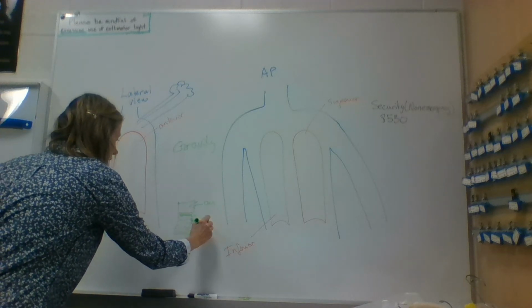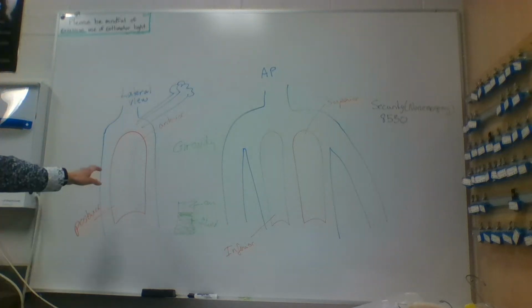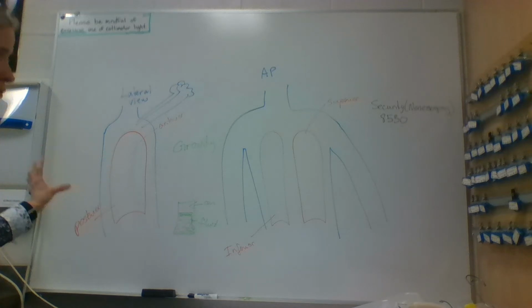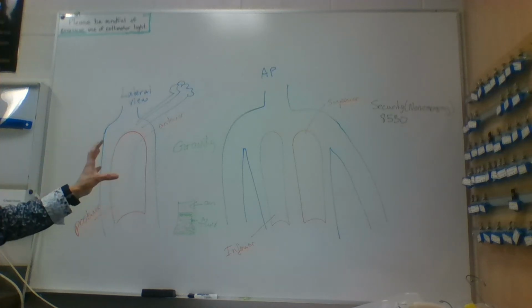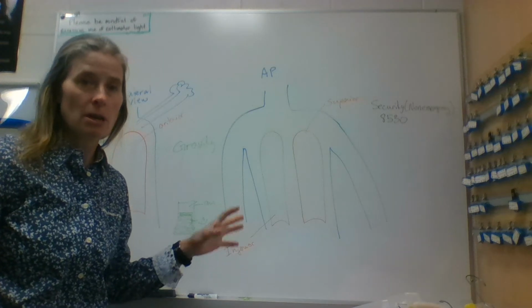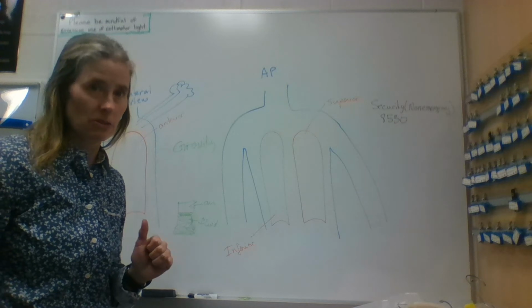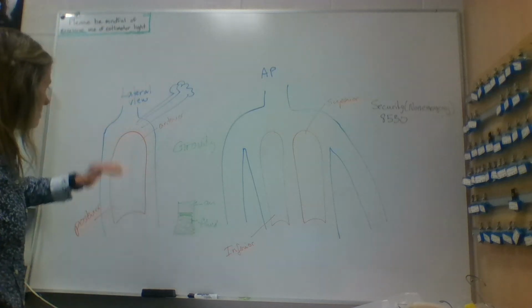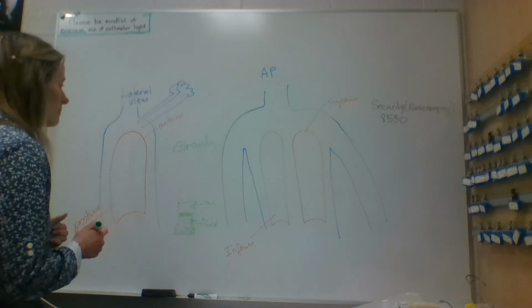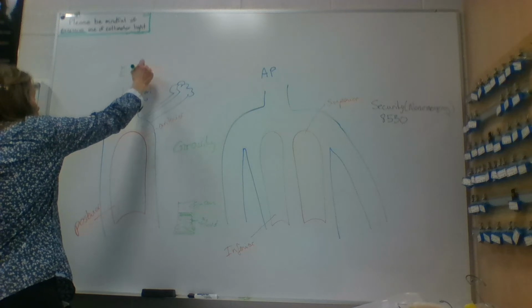And when it comes to chest tube insertions, the reason I'm letting you know this is so you know, when this has to be performed in, say, the x-ray department, what kind of position the patient has to be in so we can prep that patient for this chest tube insertion. So if it's air, air rises. Let's keep in mind we're talking about the patient being erect.